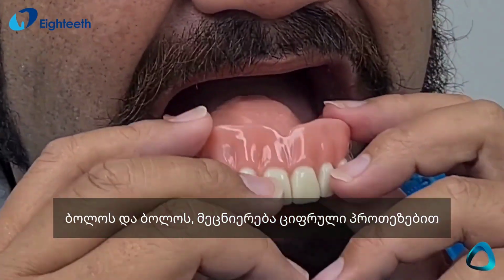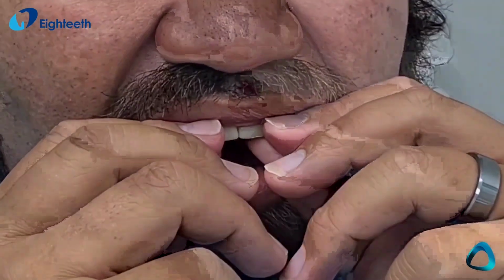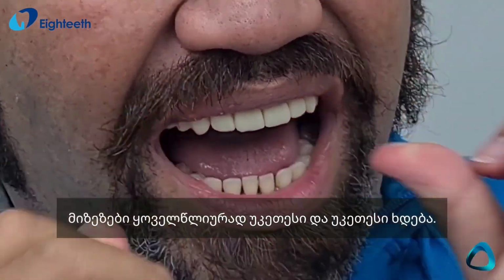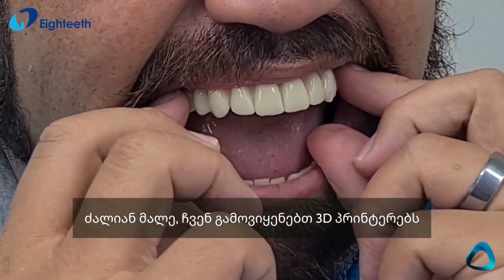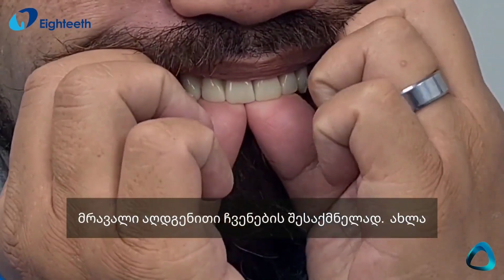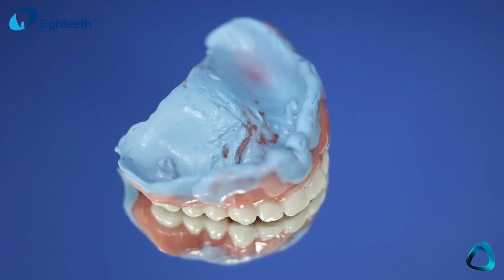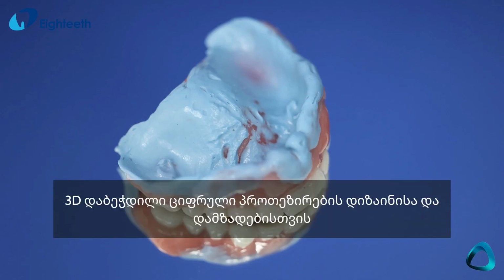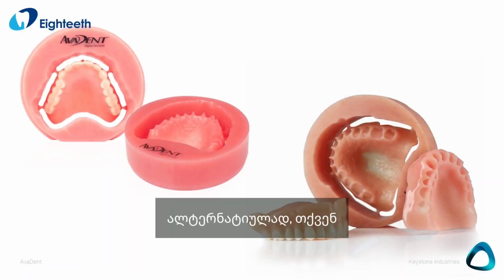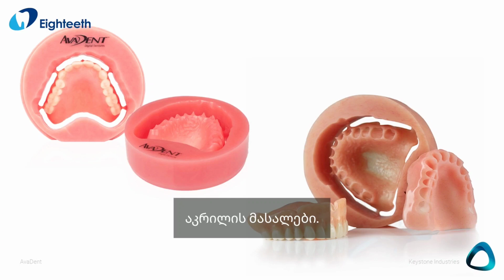Finally, digital dentures. We are moving into an era of 3D printing in dentistry. The resins are getting better and better every year. Very soon we'll be using 3D printers to fabricate many restorative indications. In our practice, we use scanners in combination with wash impressions to design and fabricate 3D printed digital dentures. Alternatively, you can also mill these dentures from a range of acrylic materials.